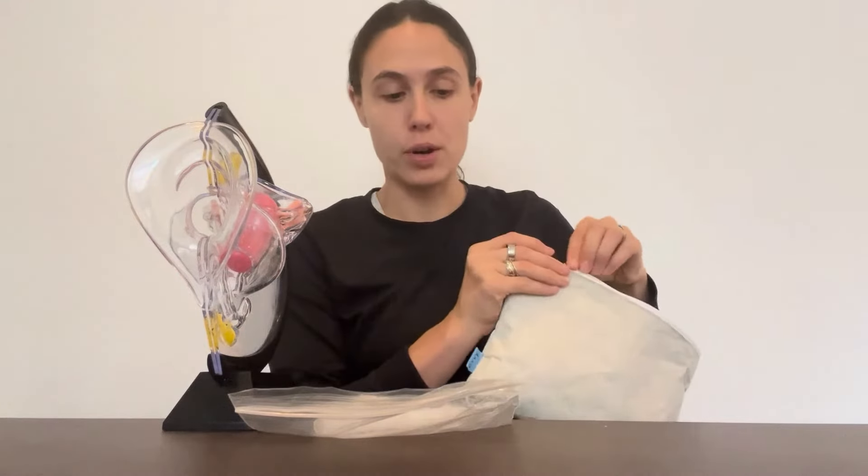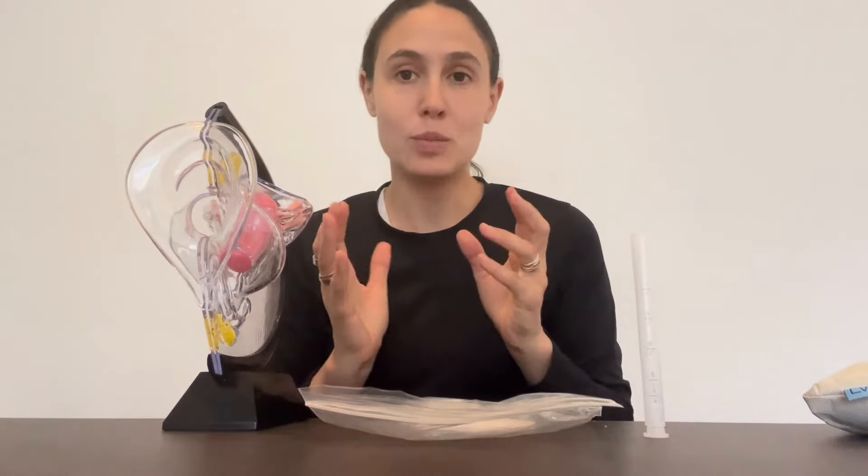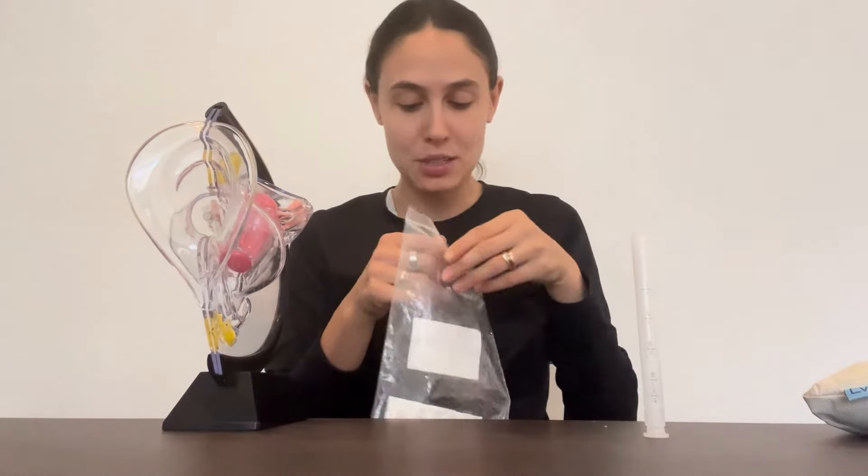I know that inserting vaginal suppositories can feel a little intimidating, but it doesn't have to be and you get used to it. So let's go over how it works. I'm going to put my Evie Care pouch to the side and take my vaginal applicator. I'll stand it up like this. I washed my hands before doing this because you're dealing with your vagina and you want everything to be clean.